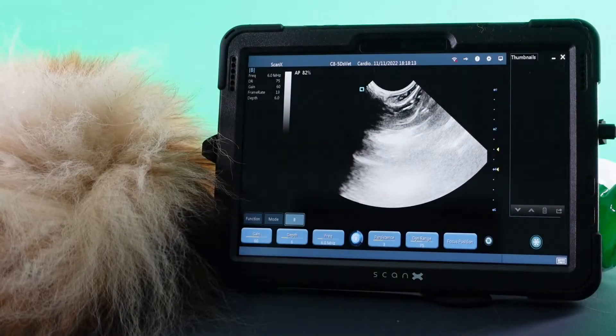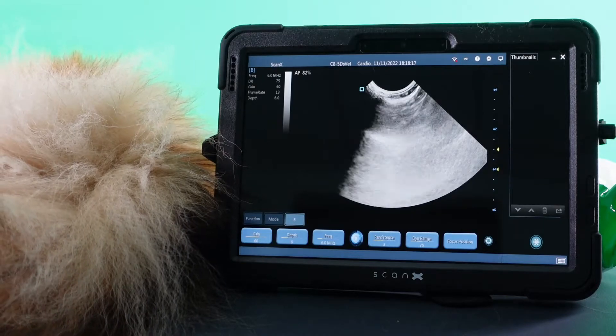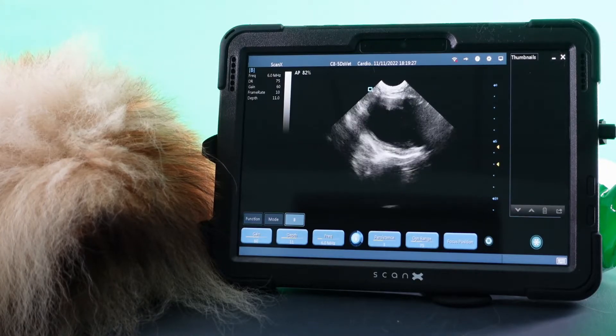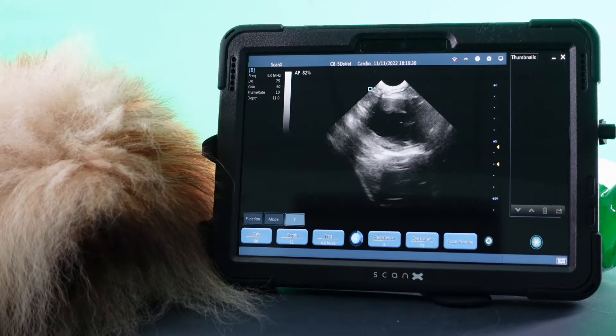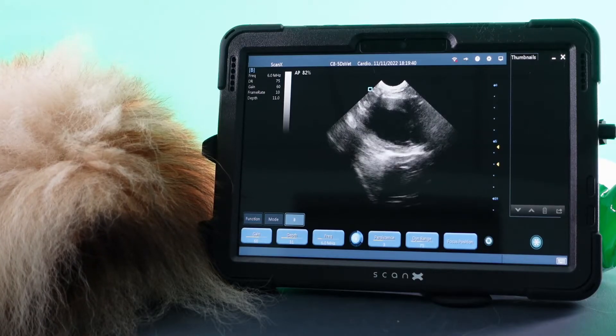I have Doppler ready in right lateral recumbency and I'm just going to pop the probe on. I've got a long axis view here. My depth is quite far out and I can see that there is no pleural effusion, no fluid underneath the heart, and no pericardial effusion — no black fluid around the heart. So now I can afford to reduce my depth to fill up all of the screen with the heart.